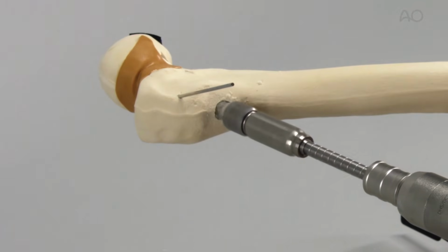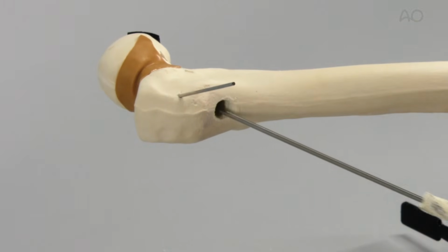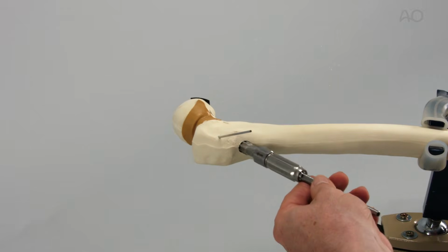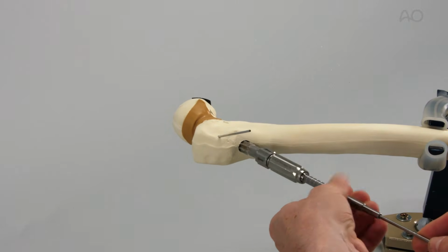Clinically, the migration of the guide wire must be controlled during reaming with regular image intensification. Note that if the guide wire is removed inadvertently, it must be centrally reinserted into the reamed hole. To reinsert the guide wire, the reamer is manually inserted into the reamed hole. The guide wire is passed through the cannulated drill bit and secured in the original position.